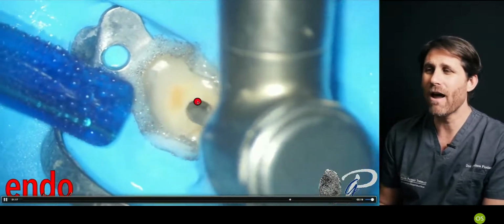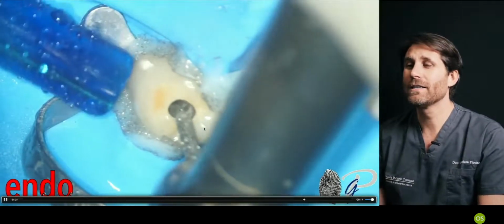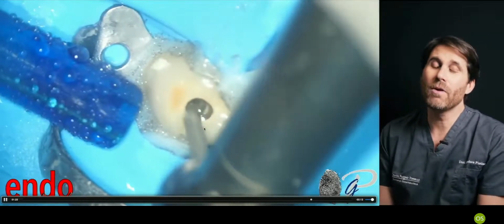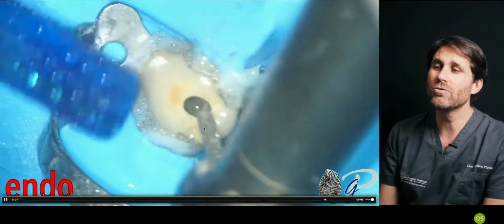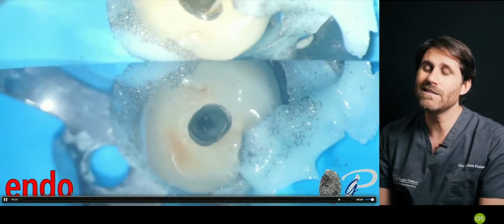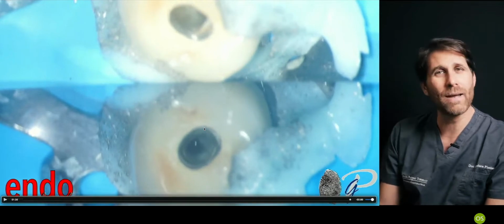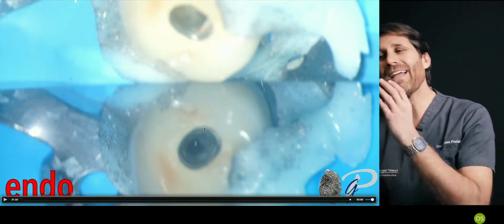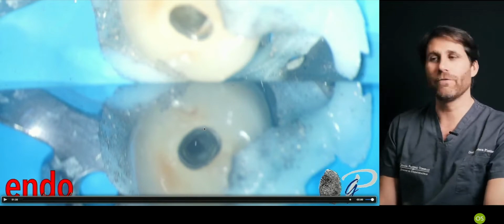Beveling the ceramic, trying to reduce the possibility of the ceramic being chipped, because the problem here is that we are creating a discontinuity in the material, in the crown. So we increase the possibility of chipping in the ceramic. We have to tell the patient that there is a possibility that the ceramic will chip in the future.